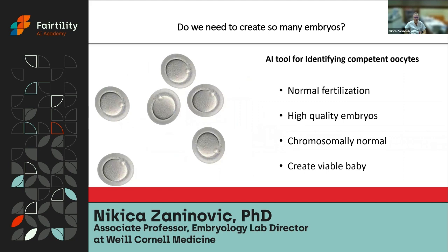So we are trying to see how we can identify competent oocytes. So if we have a cohort of, let's say, 20 oocytes, which of these 20 oocytes are really competent to create high quality embryos? So we don't really have to create so many embryos. We have a tremendous amount of embryos stored frozen, and these embryos were never going to be used, and they are going to stay there forever.